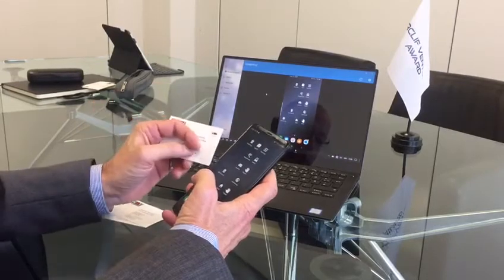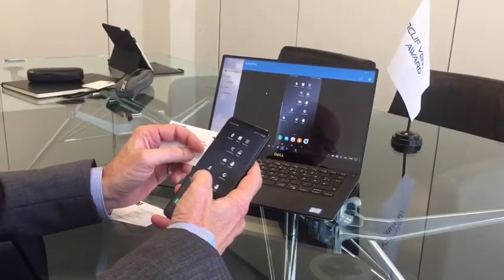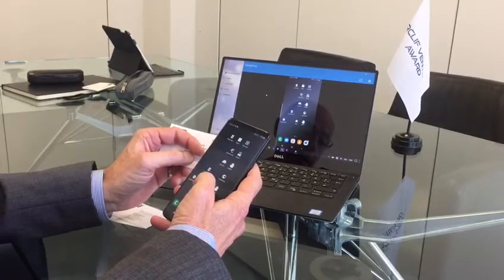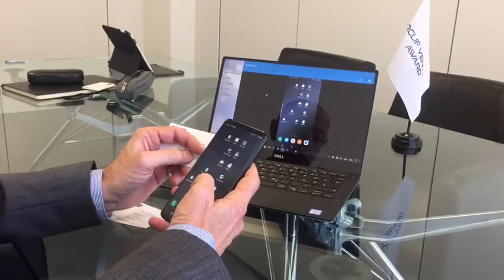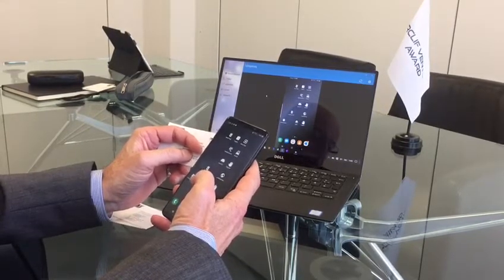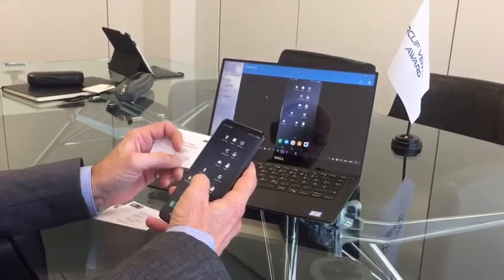So I will now run you through some of the applications which show the possibilities, not by far all possibilities, we have realized so far. And I want to start with some possibilities for how to use it in a hospital. So let me start.